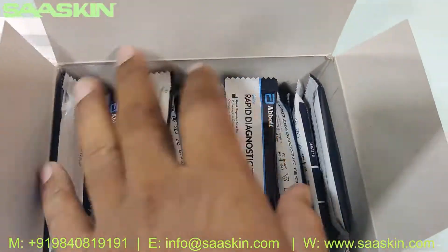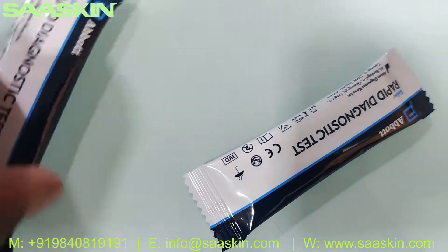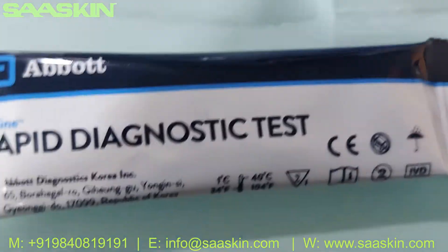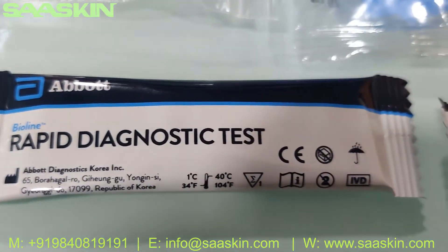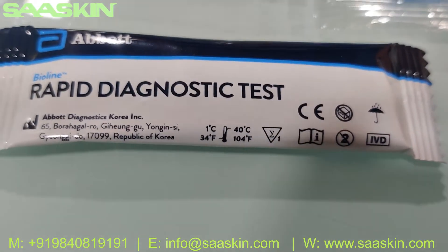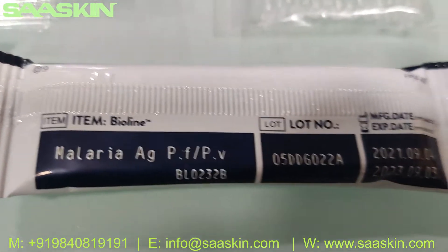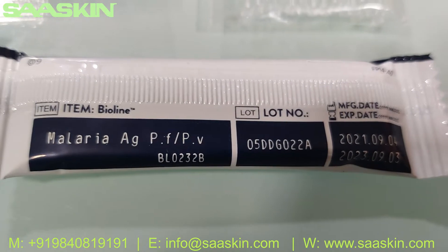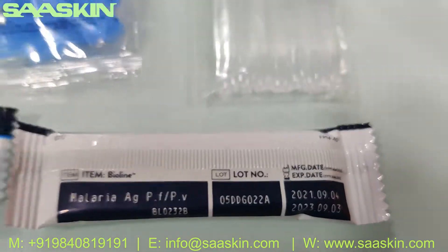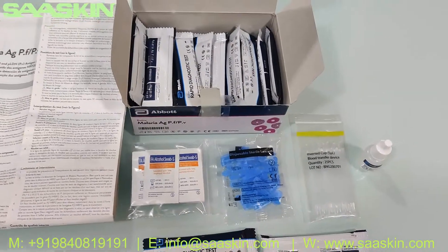Inside you have 25 test cartridges. Let me show you a closer look — these are individually packed test cartridges, or test cassettes. You can see it says 'Malaria Ag PF/PV' on the cassette, and on the back side you have the lot number and the expiry date.